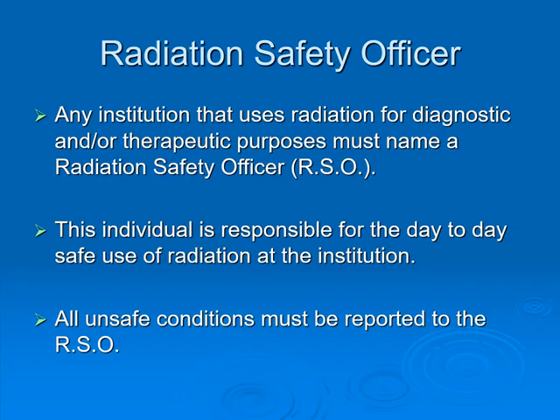Any institution that uses radiation for diagnostic or therapeutic purposes must name a radiation safety officer, or RSO. This individual is responsible for the day-to-day safe use of radiation at the institution. All unsafe conditions must be reported to the RSO immediately.